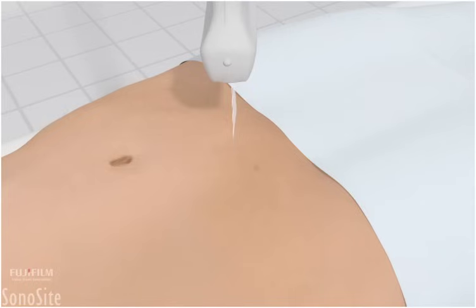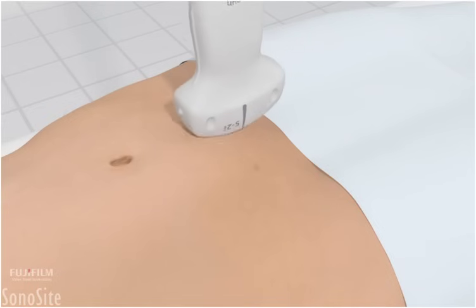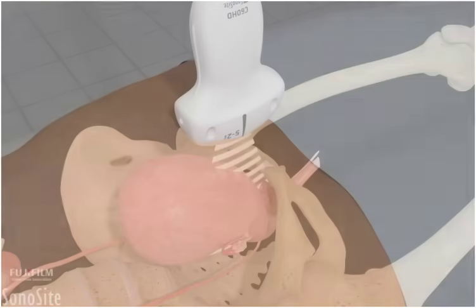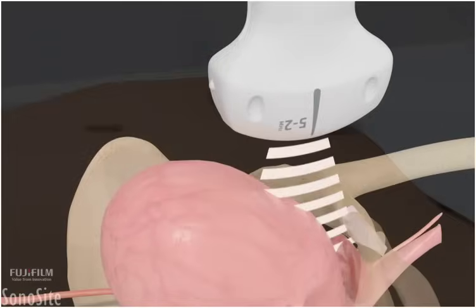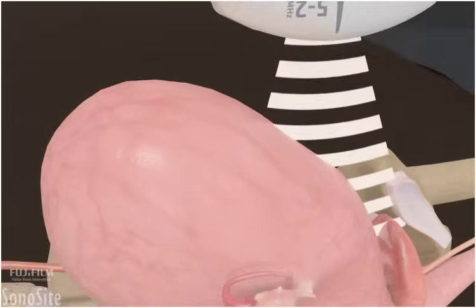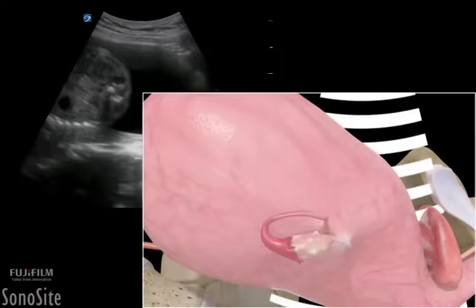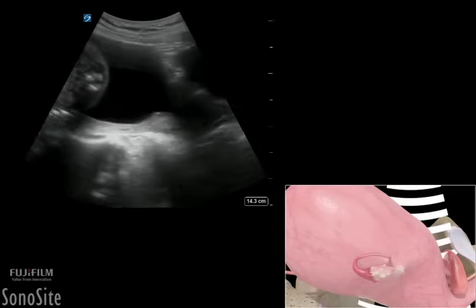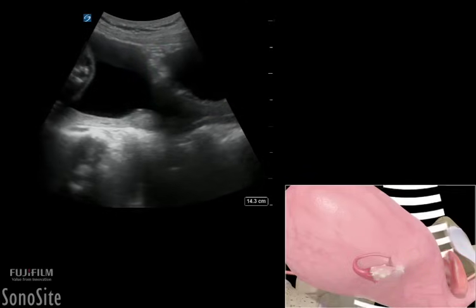The transducer is placed in a longitudinal orientation in the midline at the level of the symphysis pubis, with the orientation marker directed toward the patient's head. The transducer is angled below the pubic symphysis into the pelvis to visualize the bladder, which appears as a hypoechoic triangular structure.